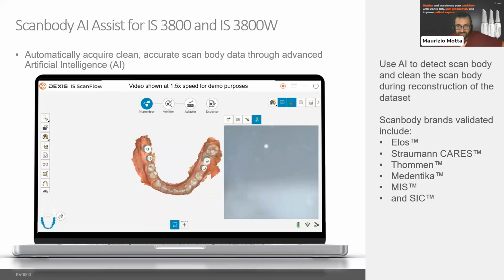In that webinar we will cover the new denture workflow. We will cover how to use the denture workflow, which options are available for that, and all the tips and tricks to have a better scan with the Dentulus and denture scan.